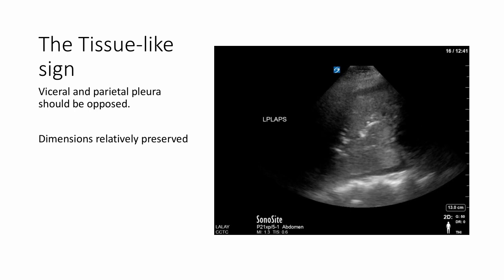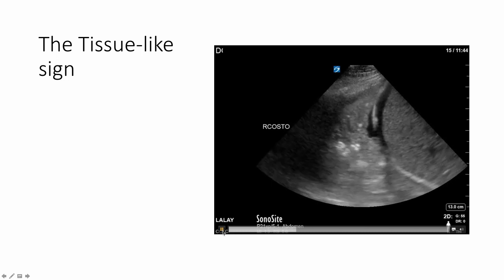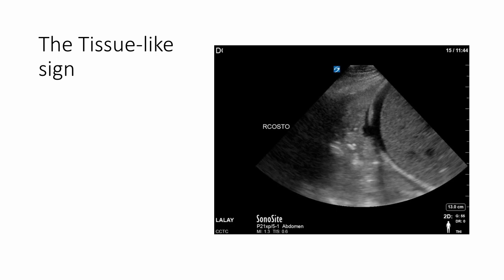The next slide represents this a little bit better. We have liver, diaphragm, a little bit of perihepatic fluid, and relative maintenance of lung architecture. Notice that the lung parenchyma looks awfully similar to the liver parenchyma. And here you can see it going with the respirations of the patient.